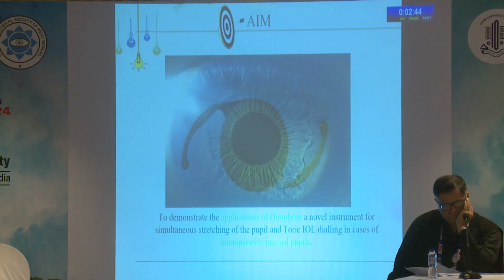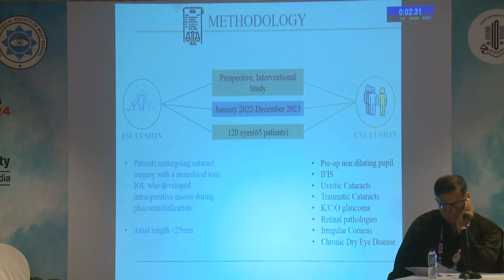So then the aim of the study was to demonstrate the applications of duoplater, which is a novel instrument for simultaneous stretching of the pupil and toric IOL dialing in cases of intraoperative miotic pupils. So this was a prospective interventional study which included 120 eyes of 65 patients.